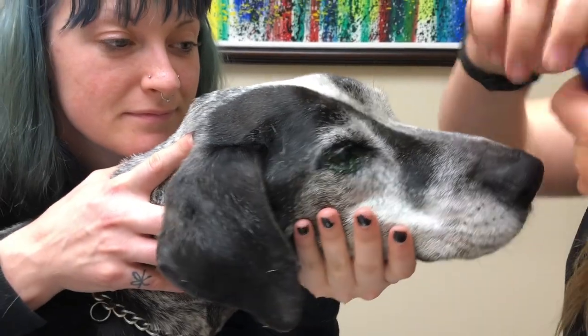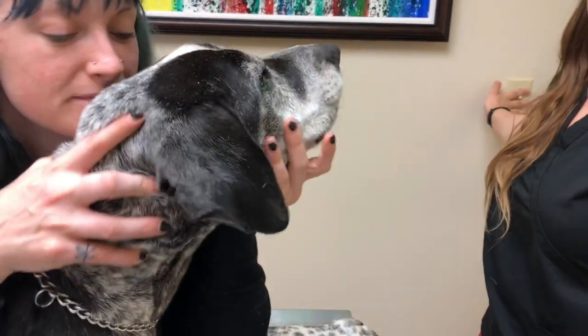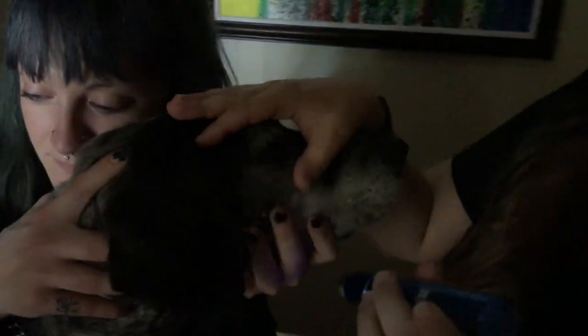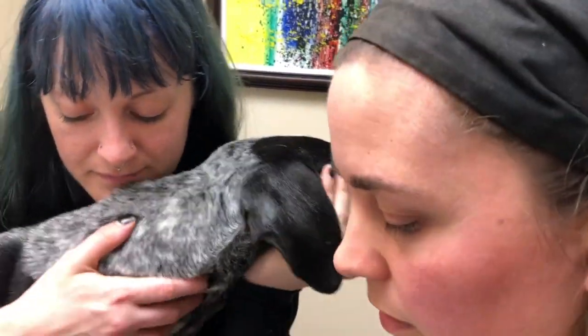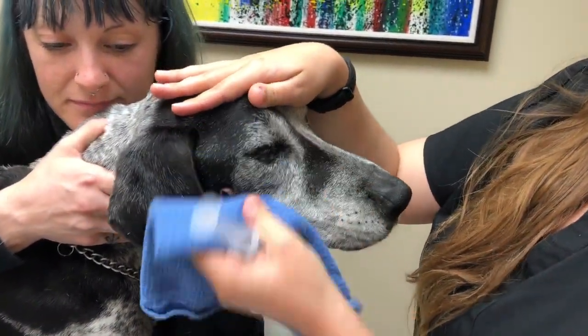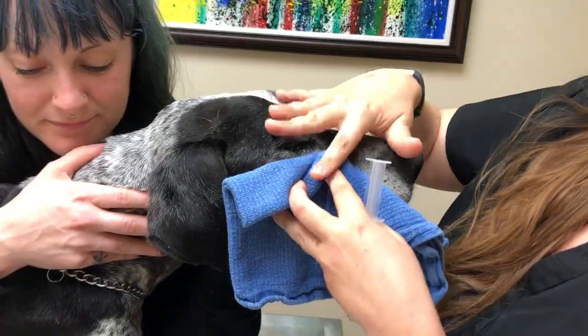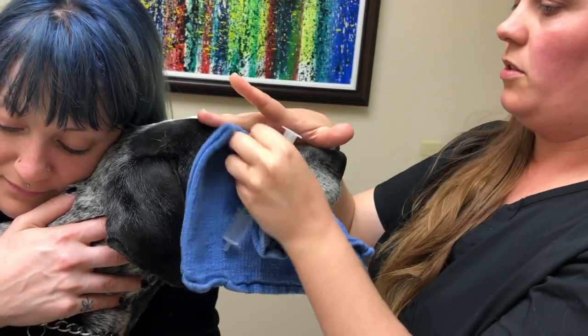I'm going to take our blue light, and we're going to take a look at his eye. So he's not quite strong enough, so I'm going to turn off the light. And we're going to look in his eye for any fluorescence of our stain, which I don't see any, so his eye is clear of any ulcers or any abrasions. And then the last part, we're going to flush his eyes some more and get out that stain. I know, you're being a good boy. So there's no excess stain.